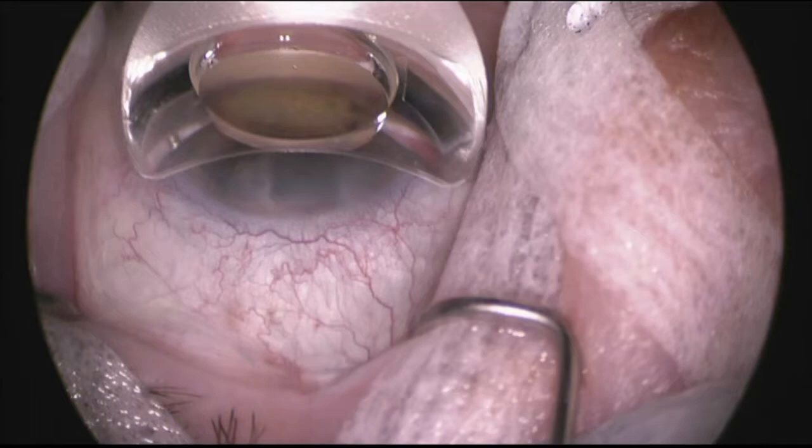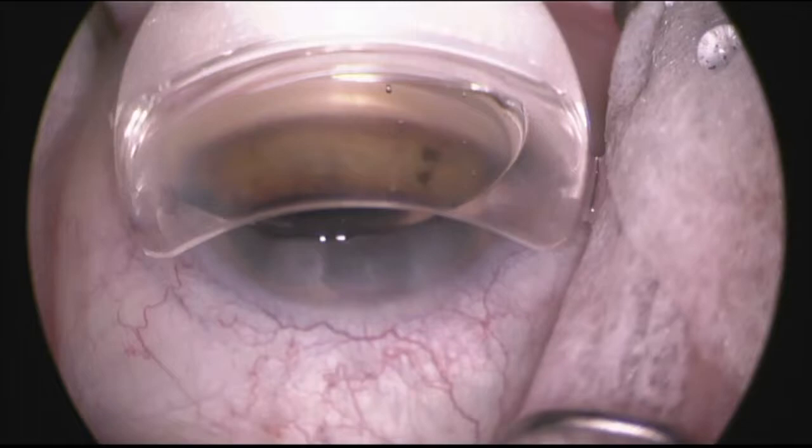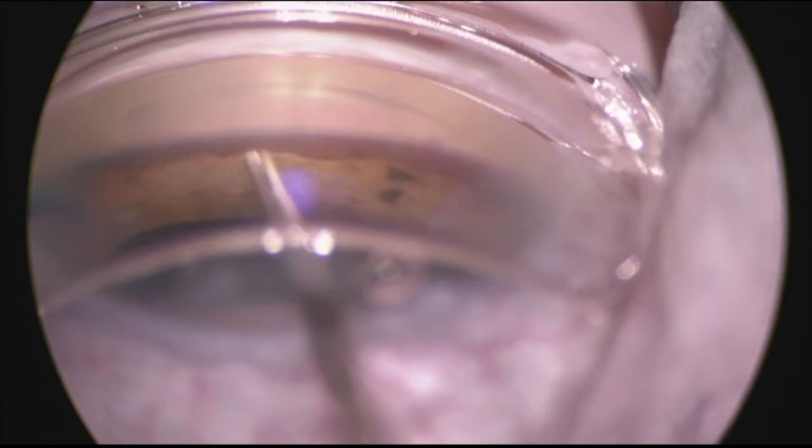After achieving excellent visualization of the angle with the gonioscopy lens, the iStent is introduced into the anterior chamber on its holder. The iStents are then inserted into the nasal trabecular meshwork.